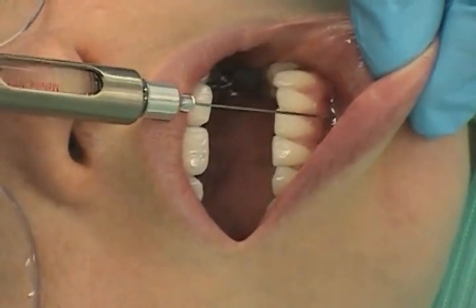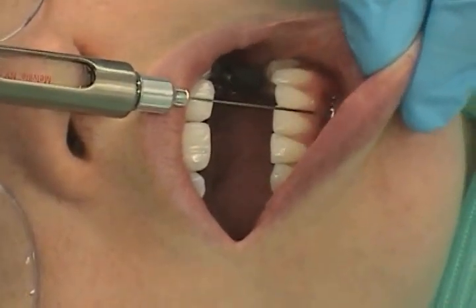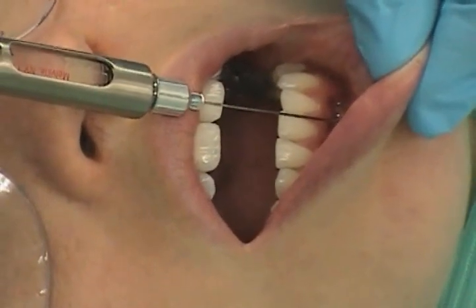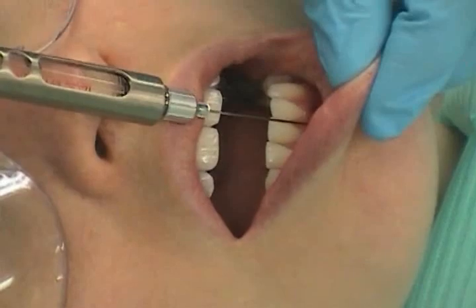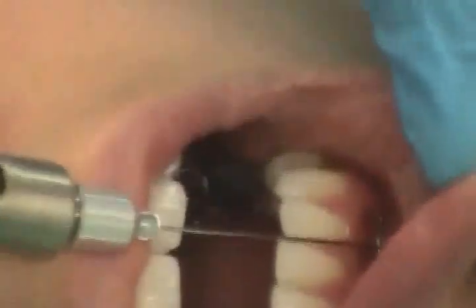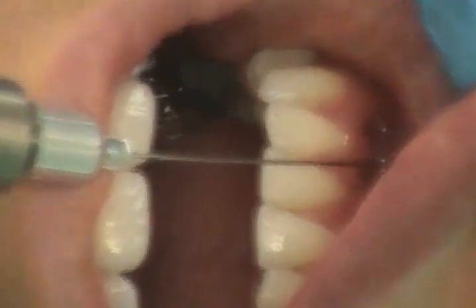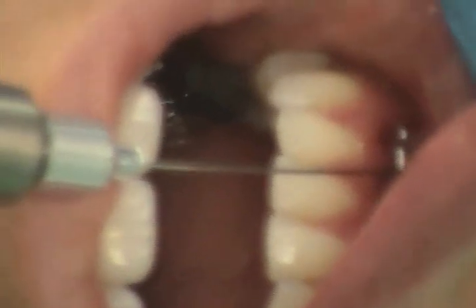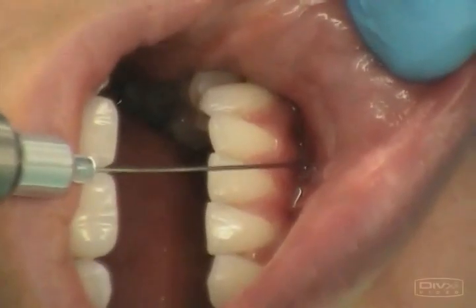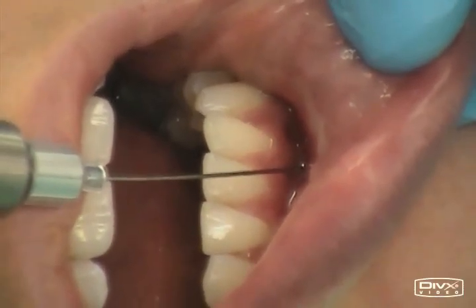The bevel orientation is going to face towards the bone. There will be no pressure anesthesia. The depth of needle insertion for the maxillary will be at the apex of the tooth; for the mandibular, until the bevel is covered about 2 to 3 millimeters. There is no osseous contact. Aspiration potential is less than 1%. Negative aspiration. The amount of solution is less than 0.6 milliliters over about 20 seconds.